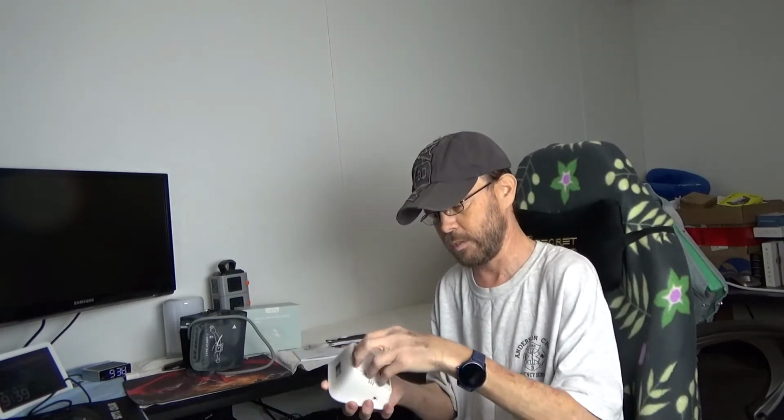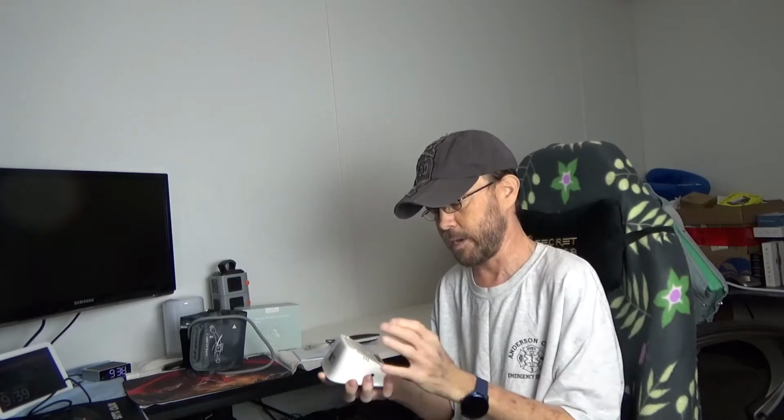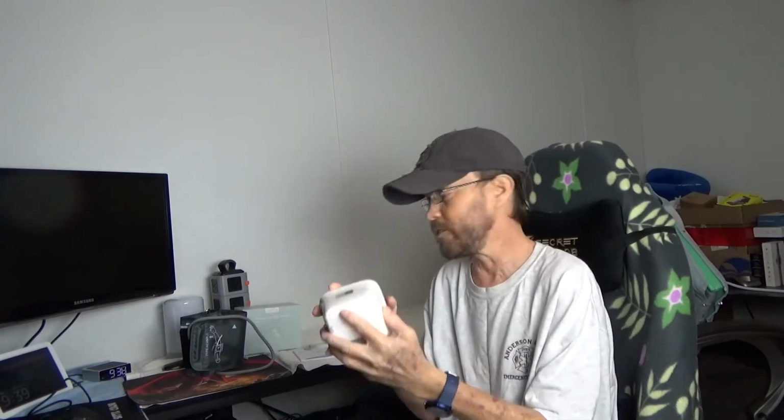I have it open on the back so you can see that it is 4 AAA battery powered, and little slits right there allow for sound, I believe. So it's like a little speaker right there, and of course there's the battery door. I just left it off long enough to be able to show you guys real quickly. So let's put this back in place. So that's quick and easy.